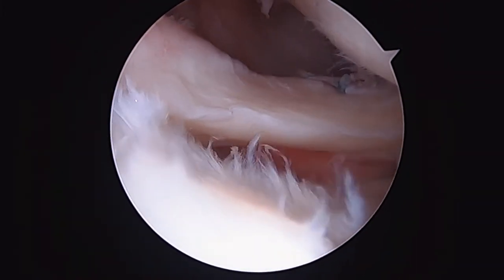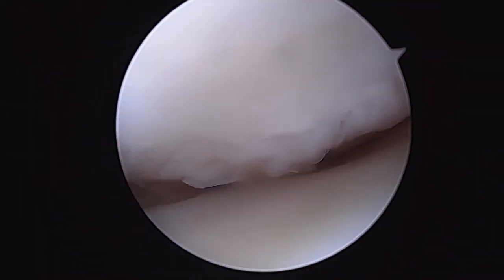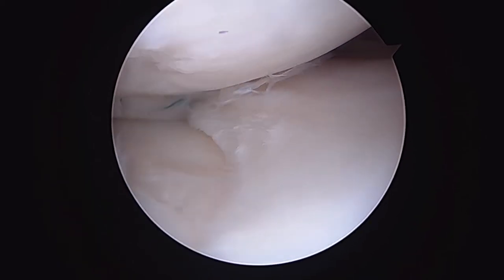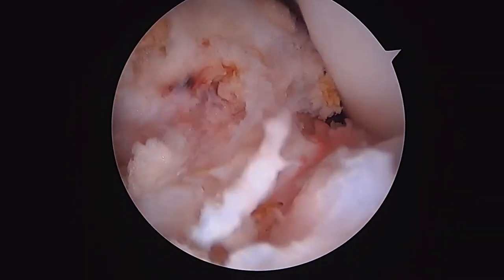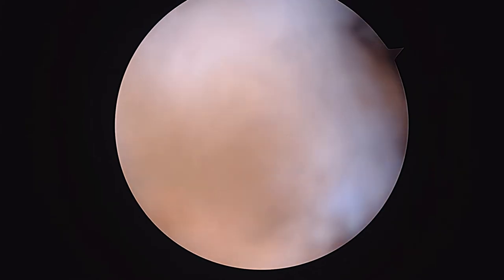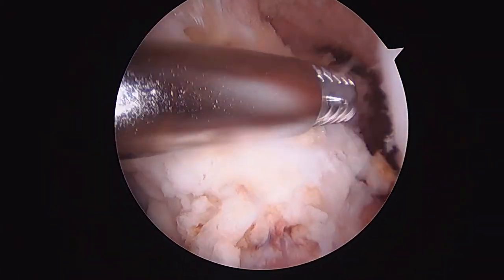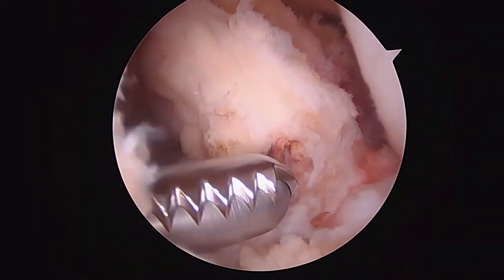We've just finished repairing the lateral meniscus. We've got one stitch here and another stitch right back there — that second one is a circumferential stitch — and it's holding that meniscus. Now we're going to go ahead and use a burr, just to make sure there's nothing in the way before we make our tunnels in the bone.